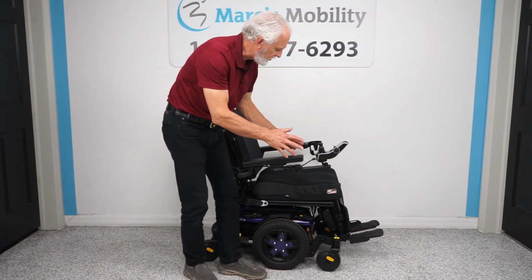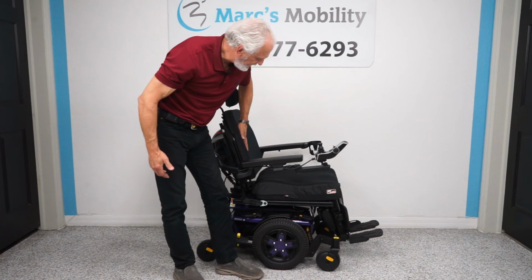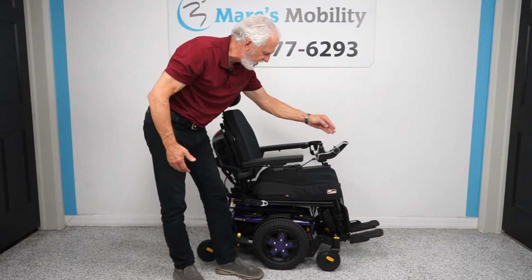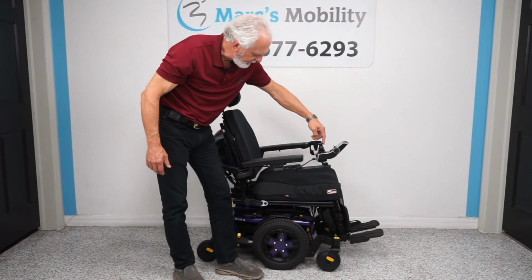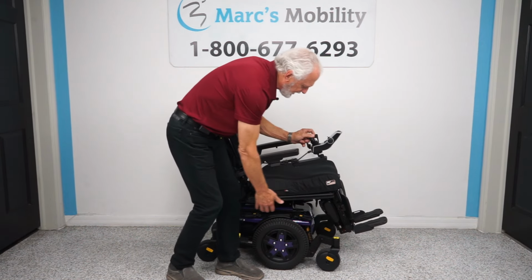So the first thing I want to show you is called the tilt. If you want the tilt, you want the bottom cushion and the back cushion to be yellow. If they're not both yellow, just move your joystick sideways. It'll change the colors on the seat. So right now it's already yellow bottom, yellow back. And if I push this back, you'll see the bottom start to go back. This is called electric tilt.